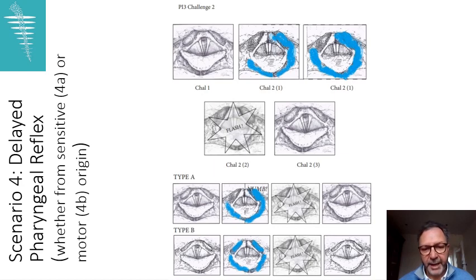Type A is mostly one-sided, and it's basically due to a lack of sensitivity that you can also assess during challenge number 4. Tickling with the tip of your fiber the epiglottis and the oropharynx, to see if there is a lack of sensitivity and compare both sides.